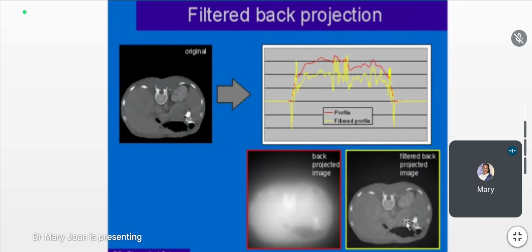So remove the signals, back project it to form the original image. Then further filter the signal, and remove more. Once the image quality is within acceptable limits, we can stop the filtered back projection kernel.